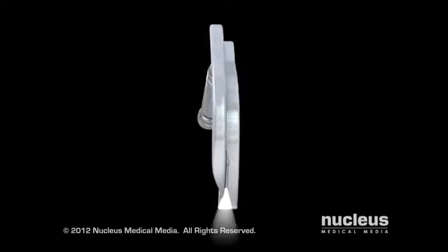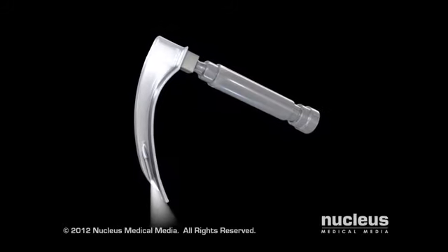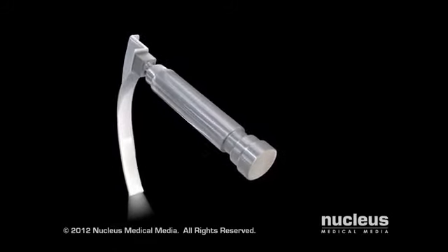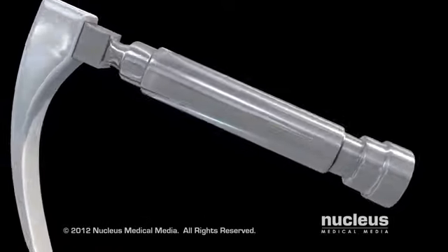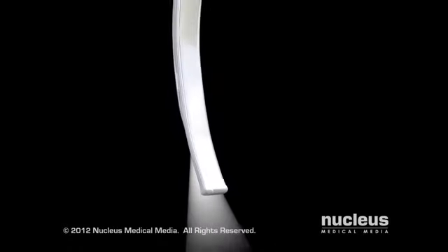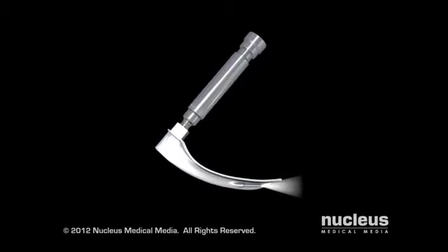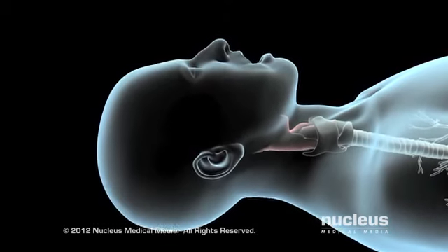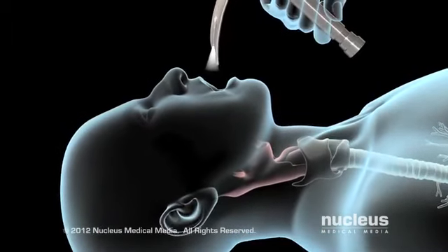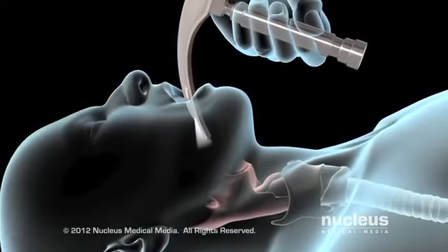The first step in mechanical ventilation is called endotracheal intubation. Once you are asleep, your doctor will use an instrument called a laryngoscope to perform the intubation. A laryngoscope, which consists of a handle, light, and dull blade, helps guide the endotracheal tube to its proper position. Your doctor will tilt your head back slightly and insert the laryngoscope through your mouth and down into your throat, taking special care to avoid contact with your teeth.